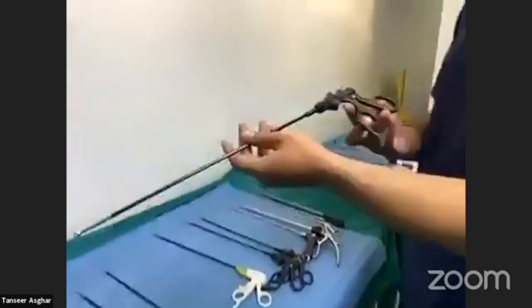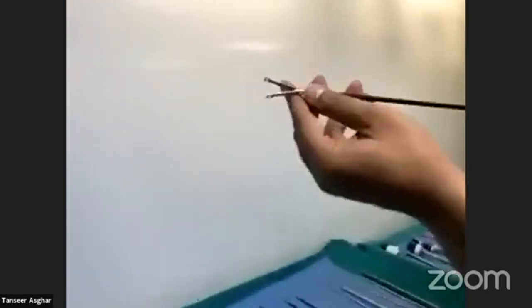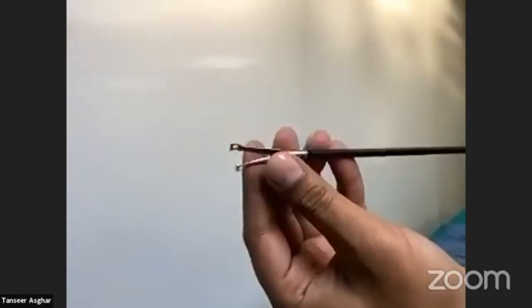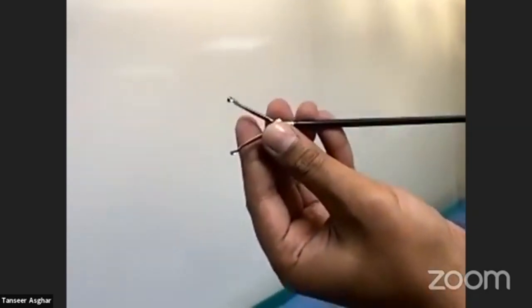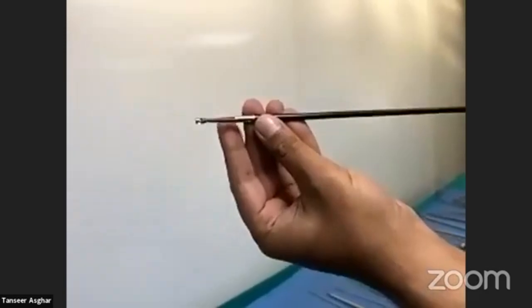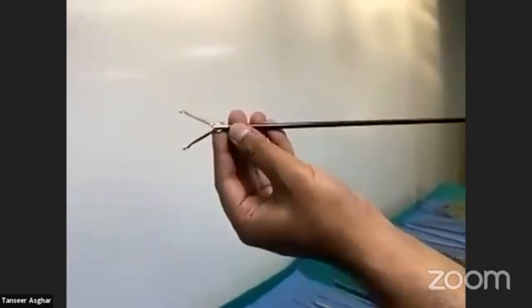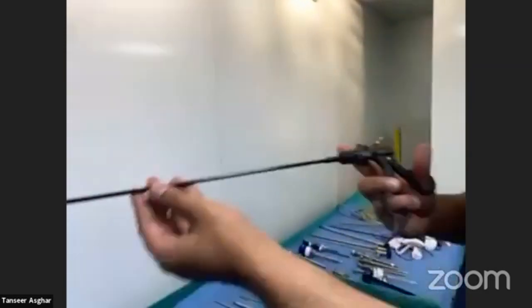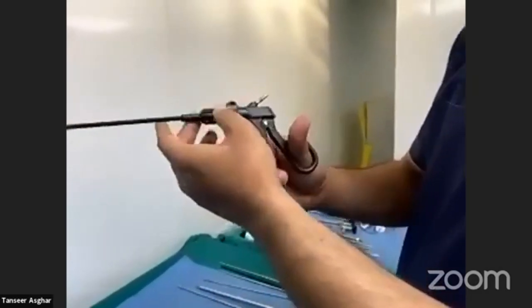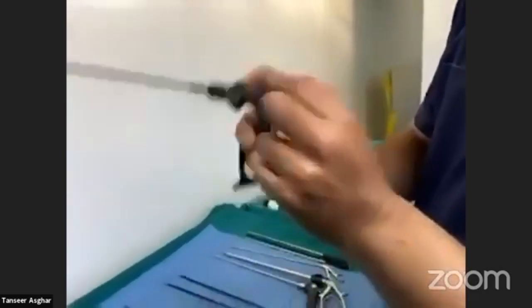This is another grasper without a lock — it is called a Babcock. It has exactly the same shape as the open Babcock. It is double-action and is typically used to grasp the bowel. It also has a rotating knob and a cautery attachment point.